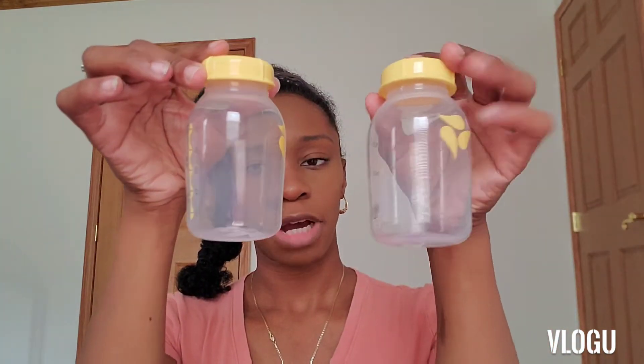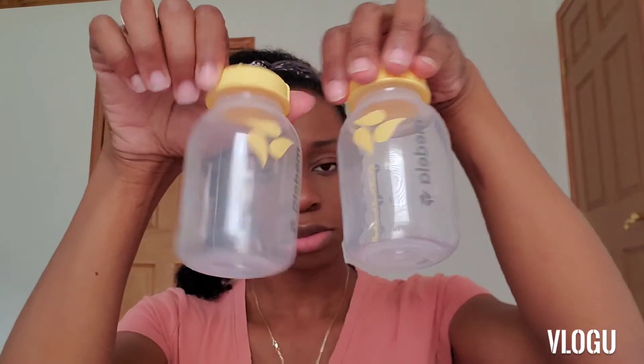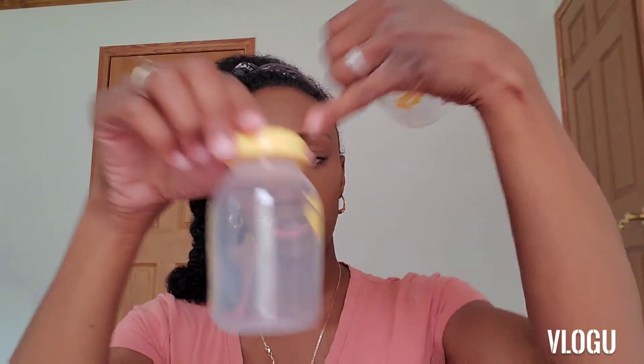Then you obviously have your bottles that you pump into — two bottles that the pump hooks to. Next is breast pads, which is pretty handy. I didn't get that in my first pump. I have two packages of breast pads, and they have an adapter for batteries if you need to pump with batteries — looks like it needs eight AA batteries.